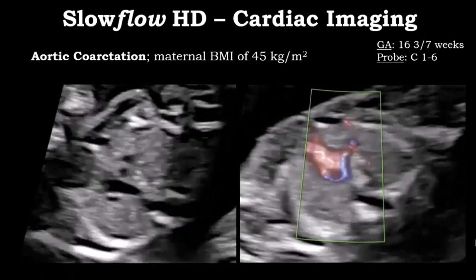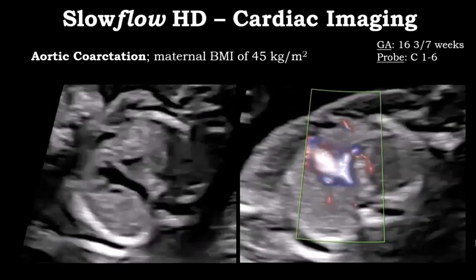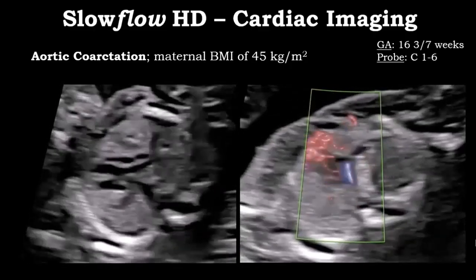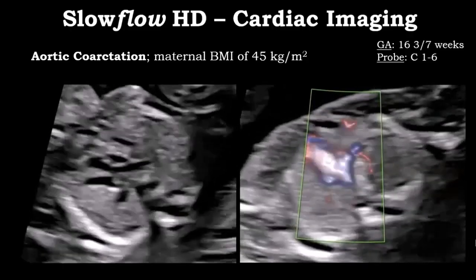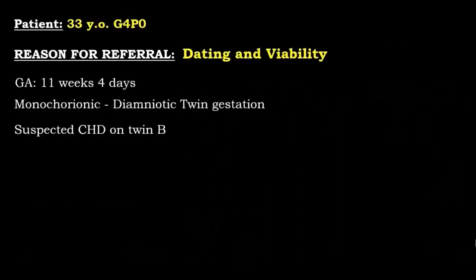So interesting enough, and it's probably hard to believe, but this patient delivered the baby, and the coarctation was diagnosed, repaired, and this baby up until this day has biventricular circulation. So that left ventricle was just small, but after birth was functional. And this is just a few cases to illustrate how critical the first trimester cardiac imaging could be for the management of different challenging situations.